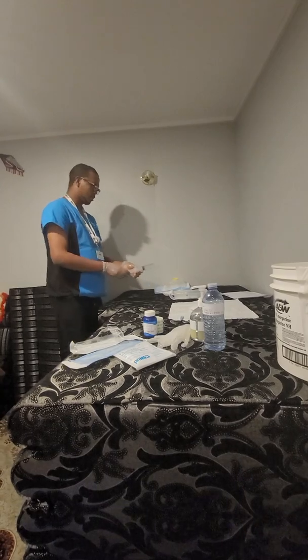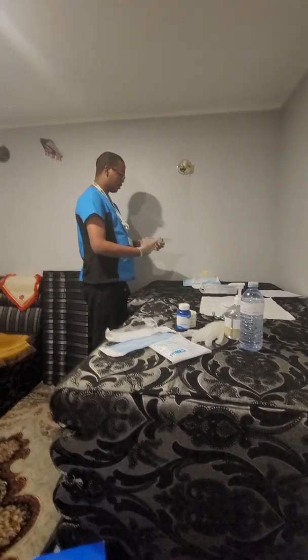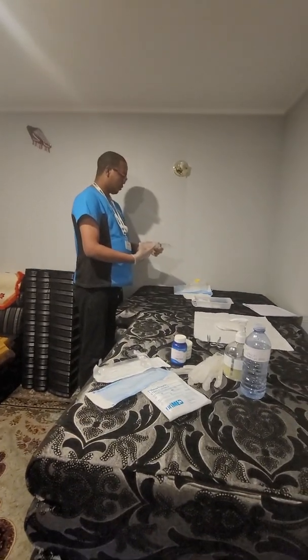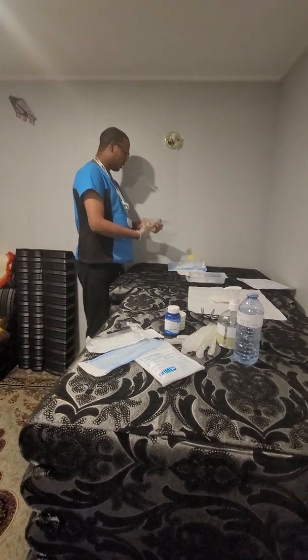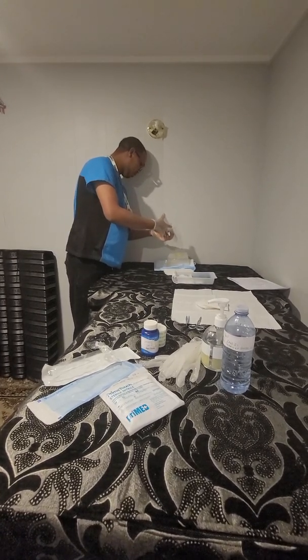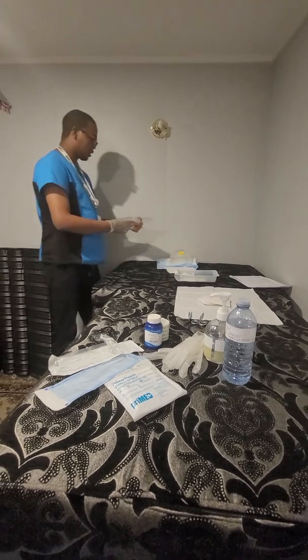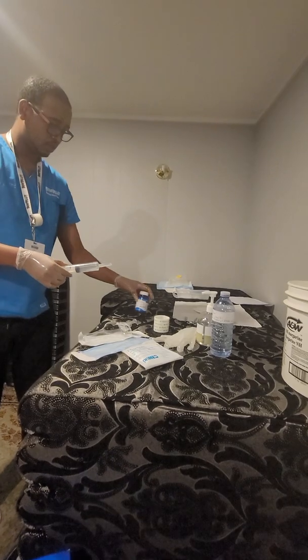Okay, so I'm gonna just irrigate it with the pressure of 5 to 15 PSI. Irrigate from top to down until it runs clean. Okay, zigzag. Okay, it is running clean now, so I'm gonna put this one to garbage.